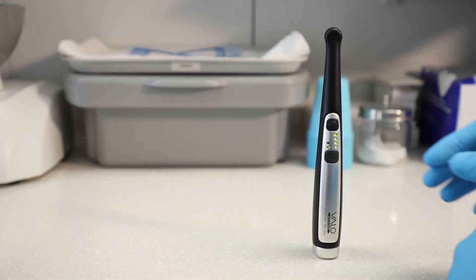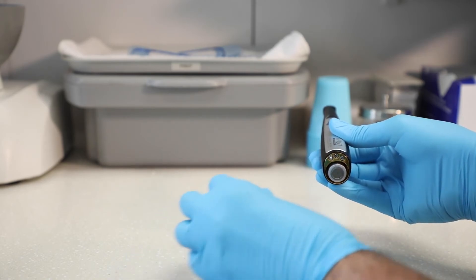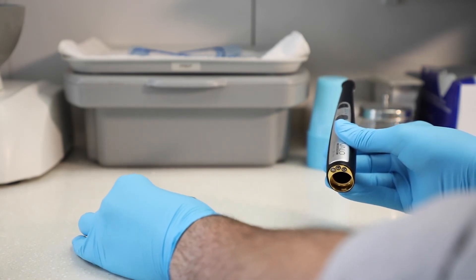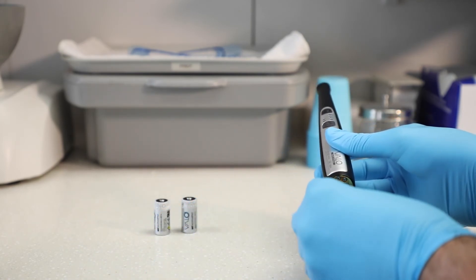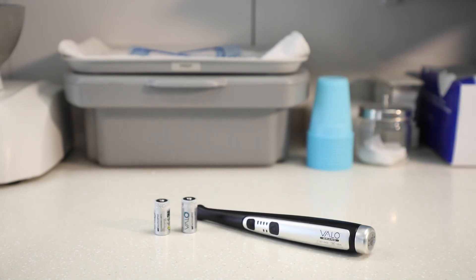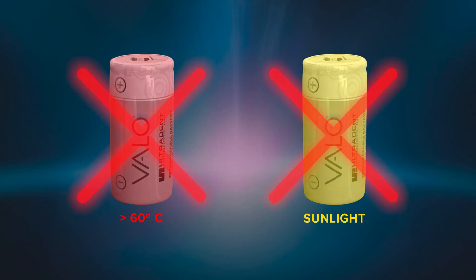If storing the curing light for periods longer than two weeks or packing it for travel, always remove the batteries. If batteries are left in the unit for long periods of time without recharging, they may become non-functional or unchargeable. Do not store batteries in temperatures over 60 degrees centigrade or in direct sunlight.